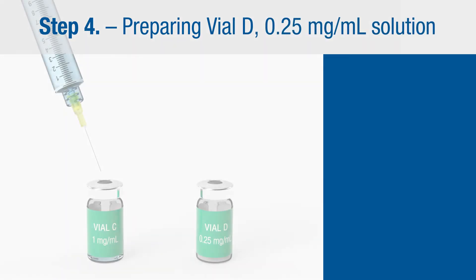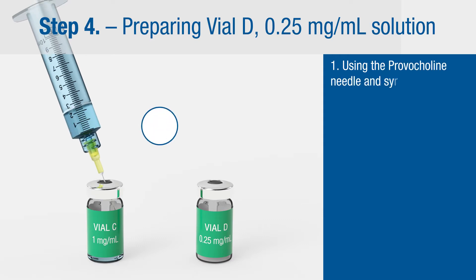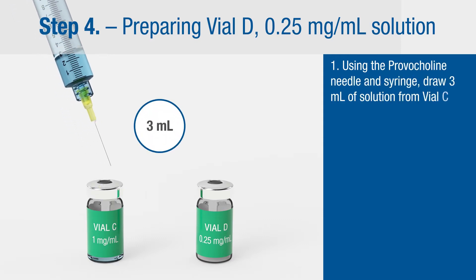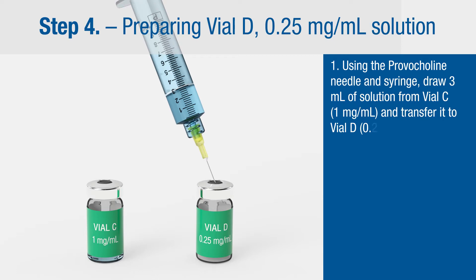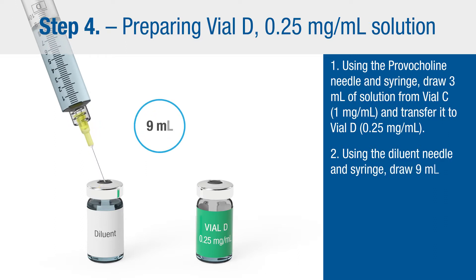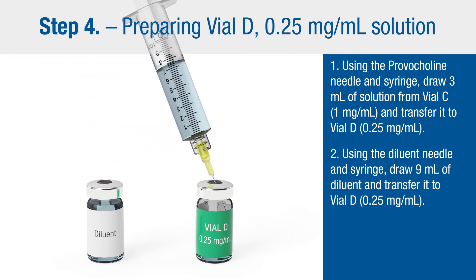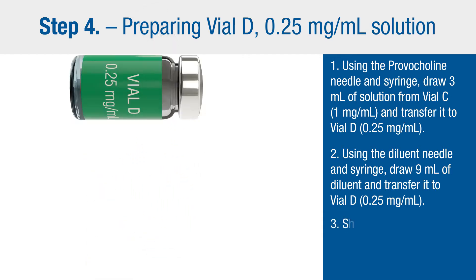Step four: preparing vial D, 0.25 milligram per milliliter solution. Using the Provocholine needle and syringe, draw 3 milliliters of solution from vial C and transfer it to vial D. Then using the diluent needle and syringe, draw 9 milliliters of diluent and transfer it to vial D. Shake well.